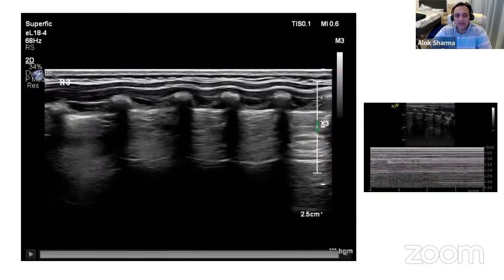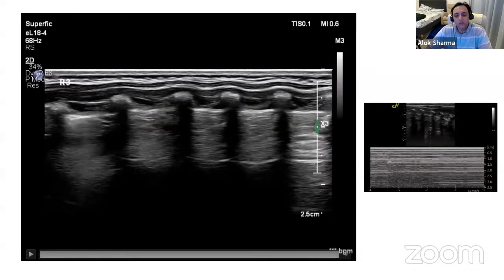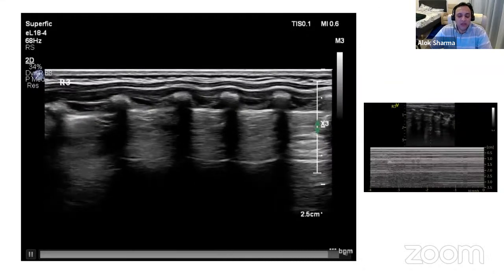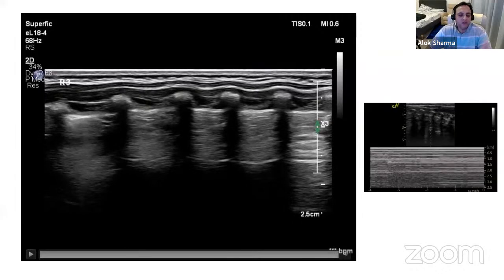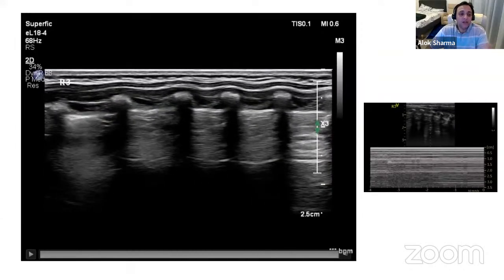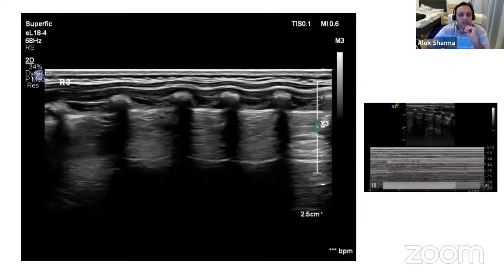But again, you'll see improvements and you'll be able to see sliding maybe all the way through, but you might still be left with an anterior pocket of air. I will be showing you a case soon where we've done exactly that. You've done serial ultrasounds over days, because it's actually taken up to 36 hours for the baby to completely get better. Any other questions?